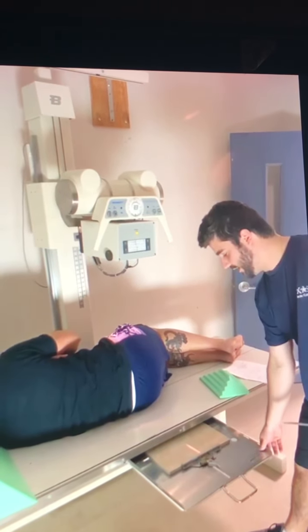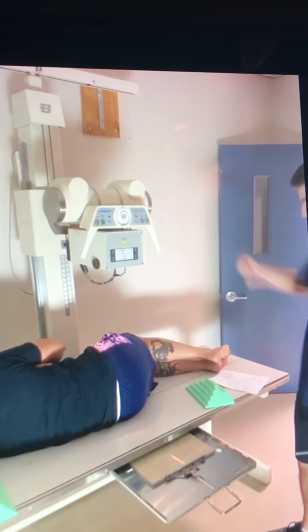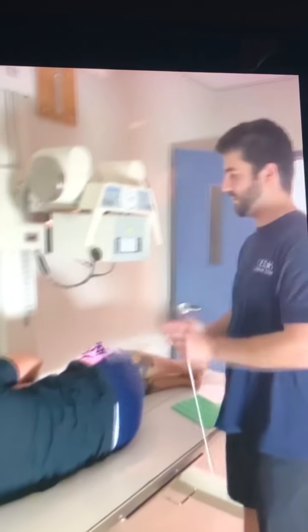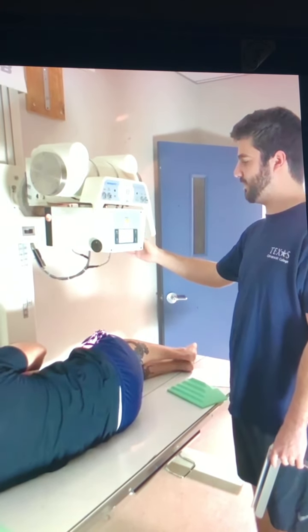We'll be using 10 by 12 film for this at 40 inches Bucky. Where we put the central ray is sagittal pelvic midline, so right on top of the pelvic, and you're at the sacral-coccyx junction, where the sacrum connects to the coccyx. You want to collimate it down to 5 by 6. So again, it's pretty small. And that is it. That was the lateral coccyx view.